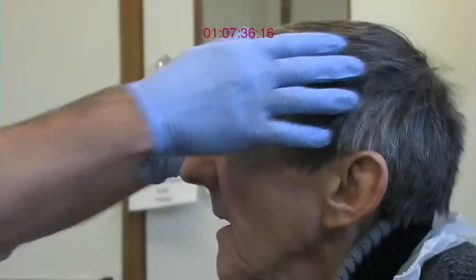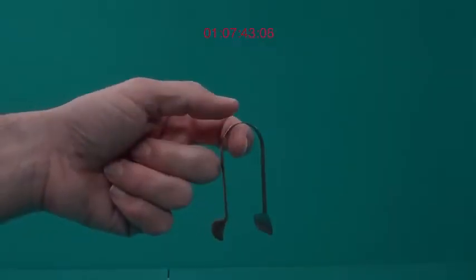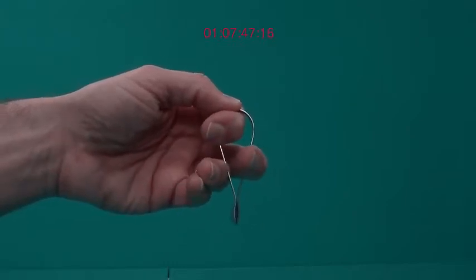Sit the patient with their eyes looking straight ahead so that the floor of the nose is in a horizontal plane. The Thudichum's speculum is used to examine the nose. It takes a bit of practice to use this instrument correctly.